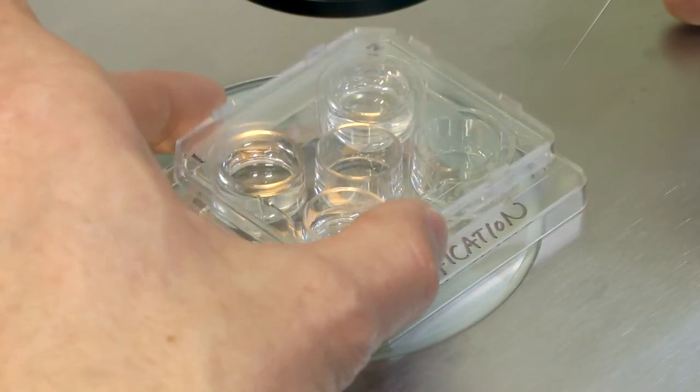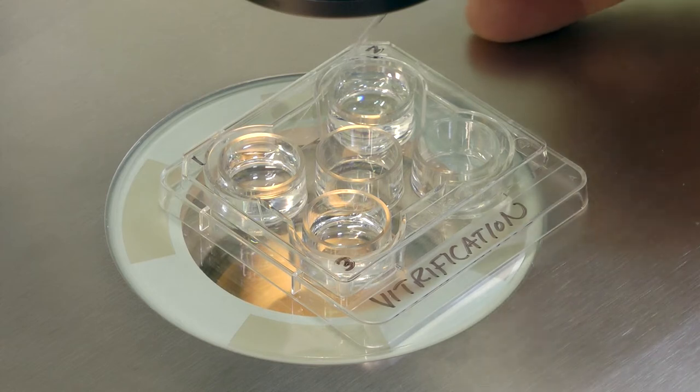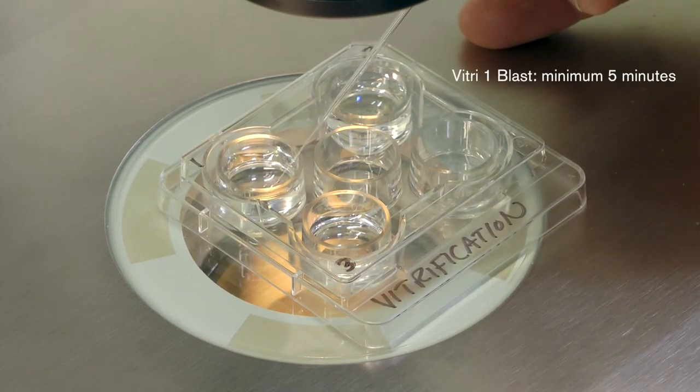Transfer your blastocyst from the culture dish into the first solution and leave it there for a minimum of 5 minutes.